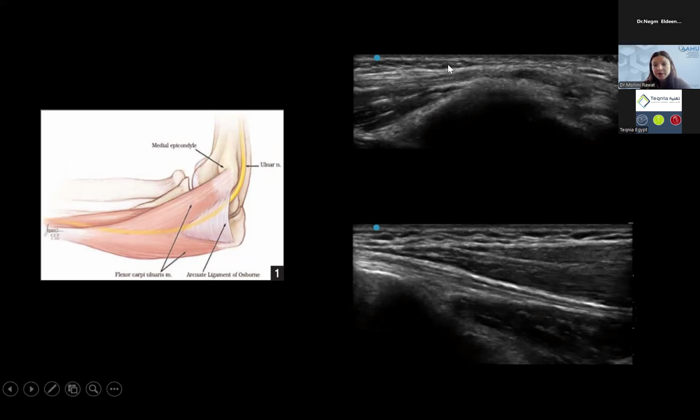So this is where the nerve wraps around the medial epicondyle, and here is the nerve entering the flexor carpi ulnaris, and when it enters, because it's surrounded by muscle tissue, it starts to show texture. Ultrasound is all about the mismatch of acoustic impedance. If a structure is surrounded by darker looking structures, it tends to look clear, in great resolution, versus if it's surrounded by a brighter structure. That's why it's much clearer around the muscle, and it can be a little fuzzy around the medial epicondyle.